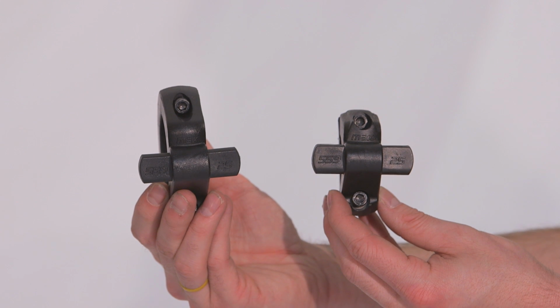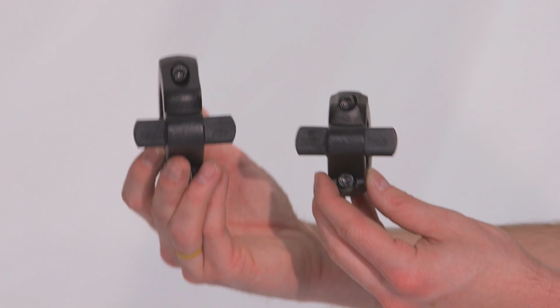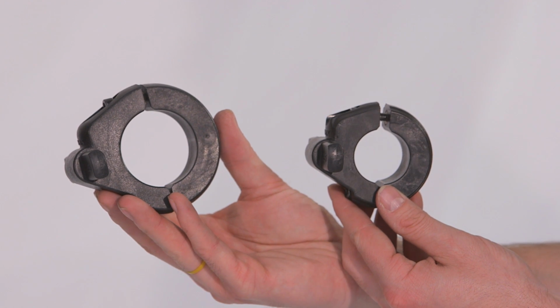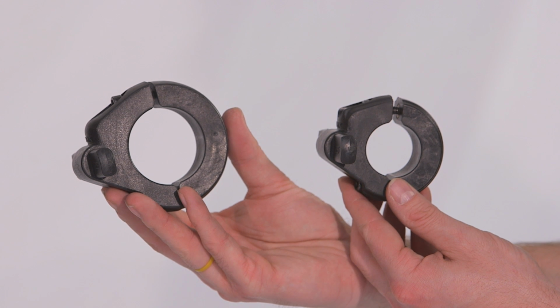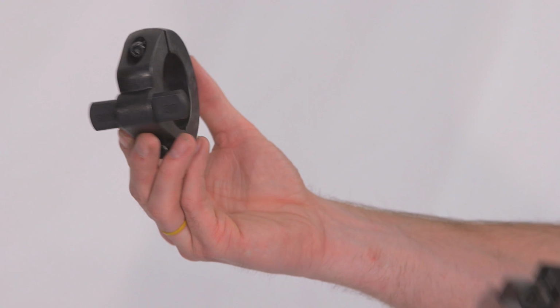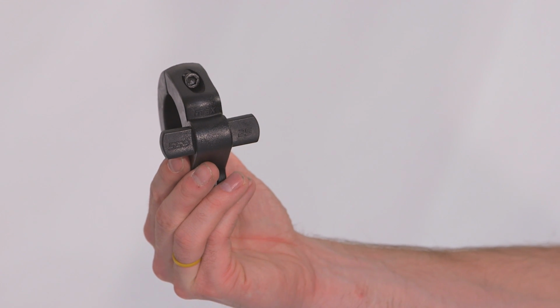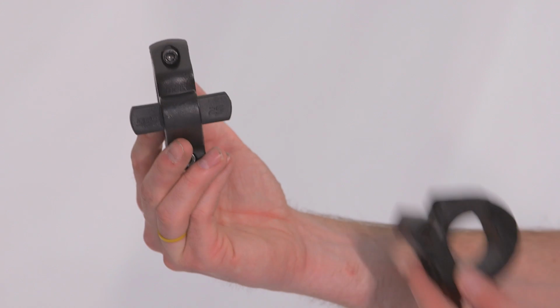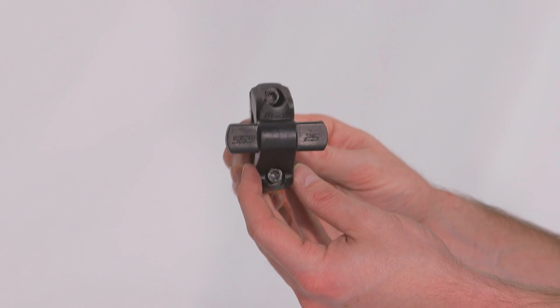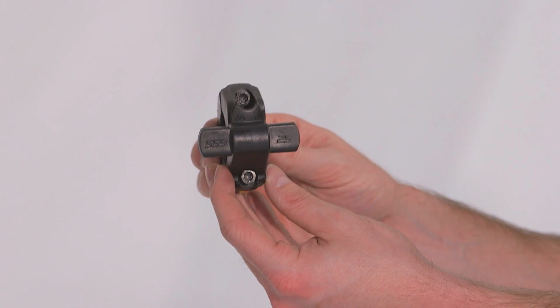First, you'll want to verify that you have the correct clamp for the wheelchair you are attaching the SmartDrive to. There are two sizes of axle clamps used for the range of axle or camber tube diameters on all wheelchairs, a large and a standard clamp. The large clamp is needed for wheelchairs with an axle tube diameter of 1.5 inches or 38 millimeters up to 2 inches. But a majority of the time, the standard axle clamp will be used, as it's able to attach to diameters 1 3/8 inches or 36 millimeters and smaller.